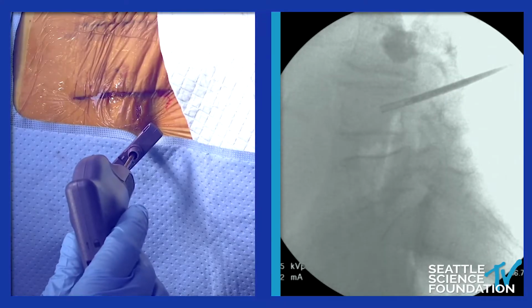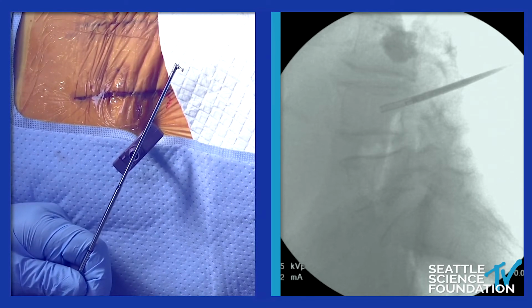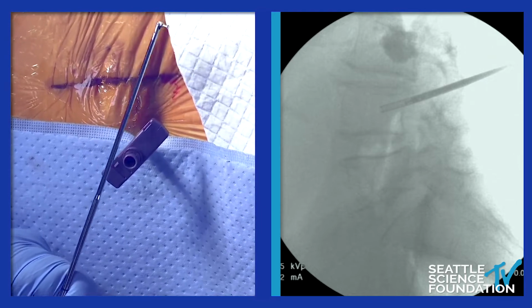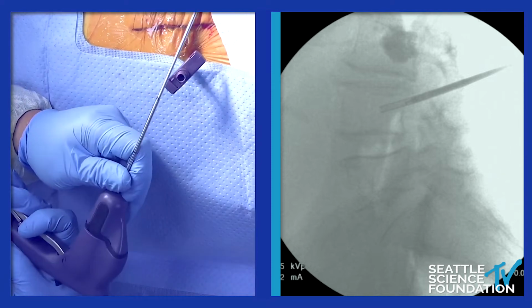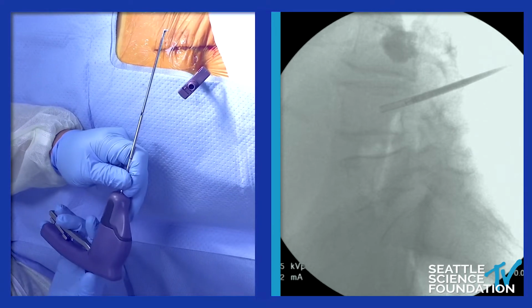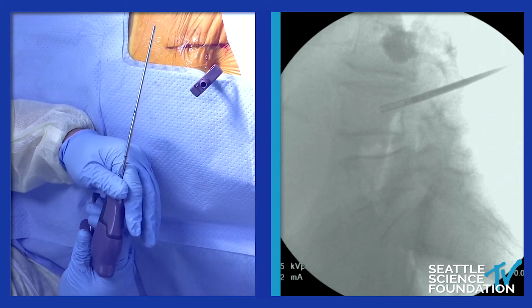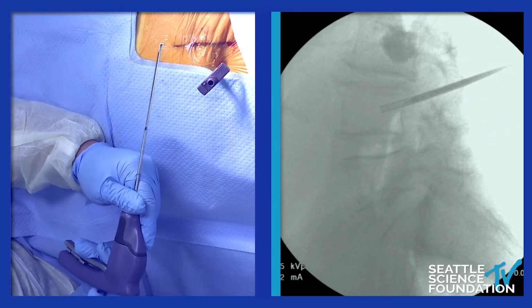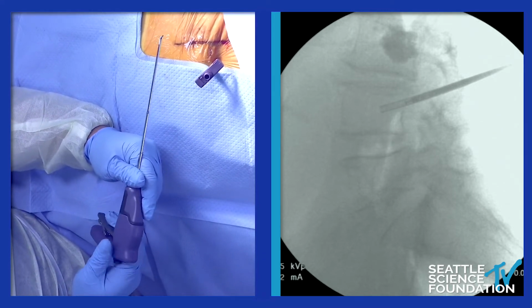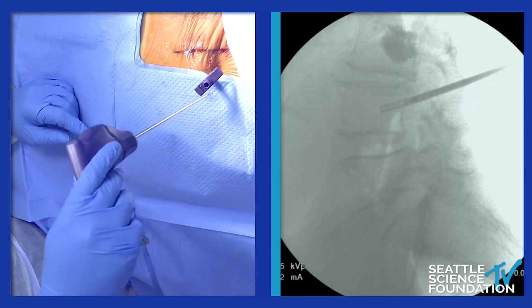What's in your hand there, Glenn? That looks like a gun. Yeah, it's called a curette, and it's used to core out the vertebral body even further. You can lock it in as well. It's used to provide even further space. Sometimes you'll have some different bony shards in the area of the balloon, and you want to smoothen it out. It helps core out even further and provide some further cavity. So let's go back to the AP view.